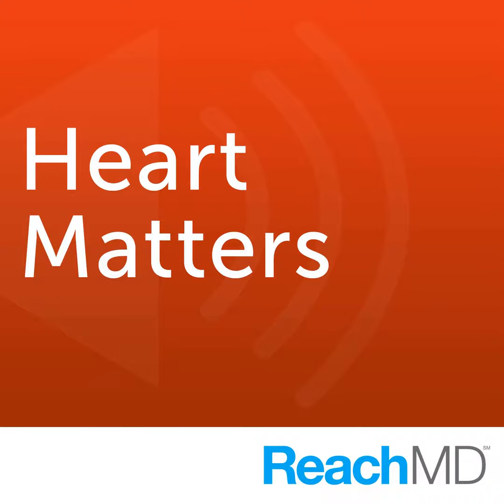And you're just looking for a certain degree of calcification in the coronary arteries because one of the pathophysiologic features of coronary atherosclerosis is that there is this tendency towards microcalcifications in the artery itself as coronary disease develops. So that is a sign of some underlying atherosclerosis.